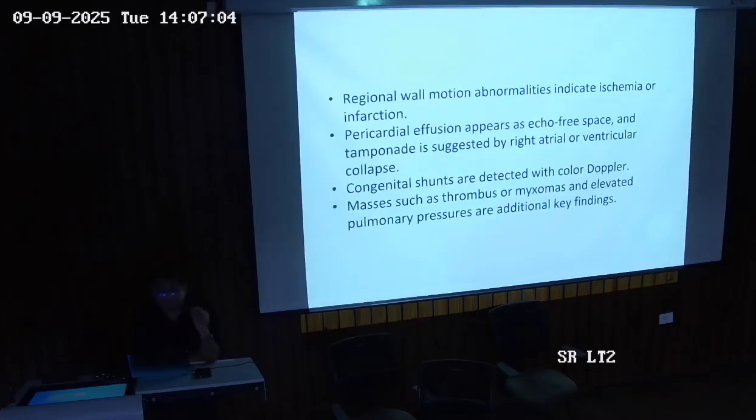Obviously, in ischemic heart disease there is a wall motion abnormality. It depends on the anterior wall, lateral wall, posterior wall, inferior wall. So a particular infarction has a particular abnormality in wall motion. Wall motion gets decreased, reduced, or sometimes absent. That is known as akinesia, otherwise known as dyskinesia or hypokinesia. So it is a wall abnormality that indicates the patient has ischemia or infarction.